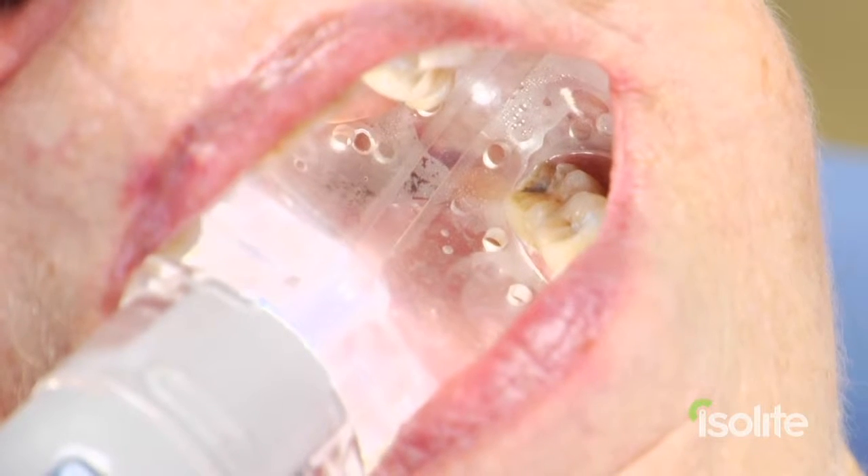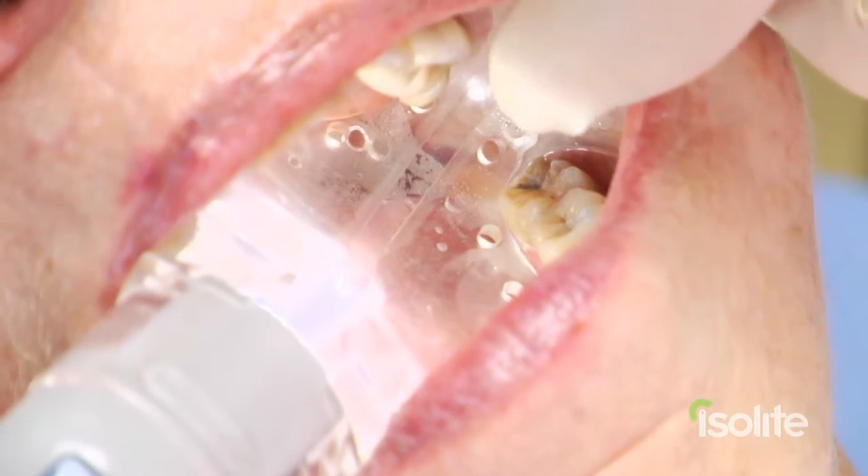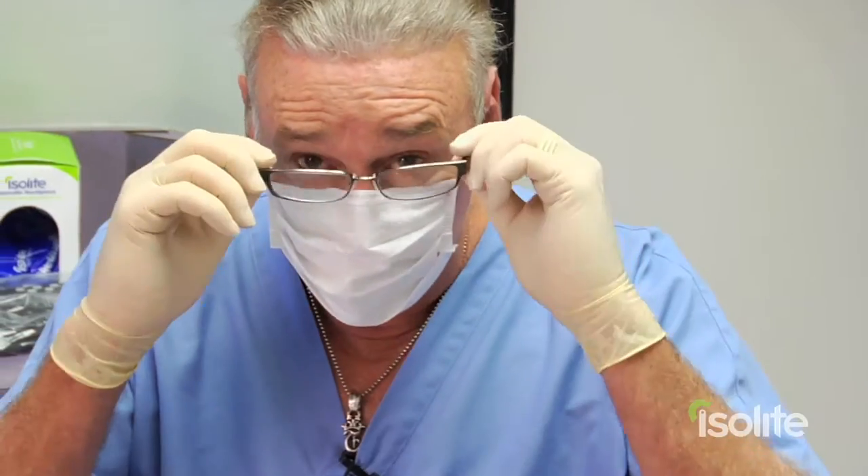Throughout the entire preparation procedure the tongue was kept out of the way — it was all isolated. It was also kept out of the way when we did the retraction, and as many of you know, Astringent X tastes horrible. The Isolite actually vacuums up any extra astringent so that the astringent X never goes down the throat or has the patient tasting it.